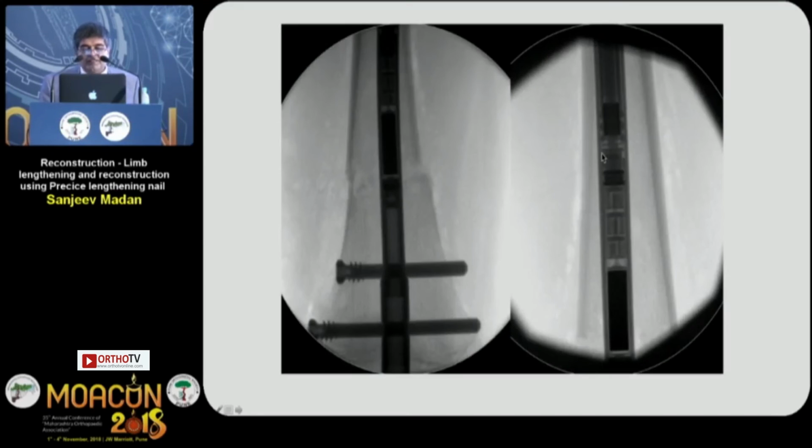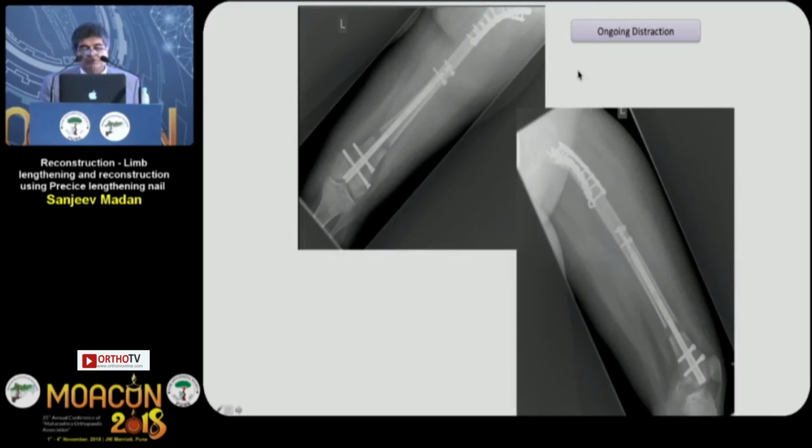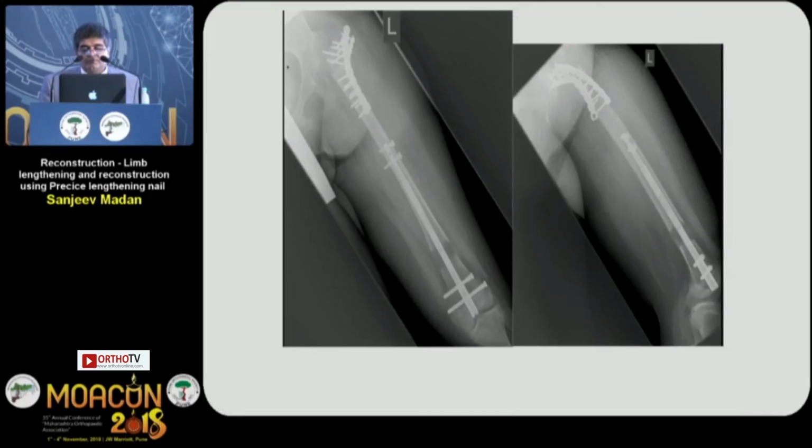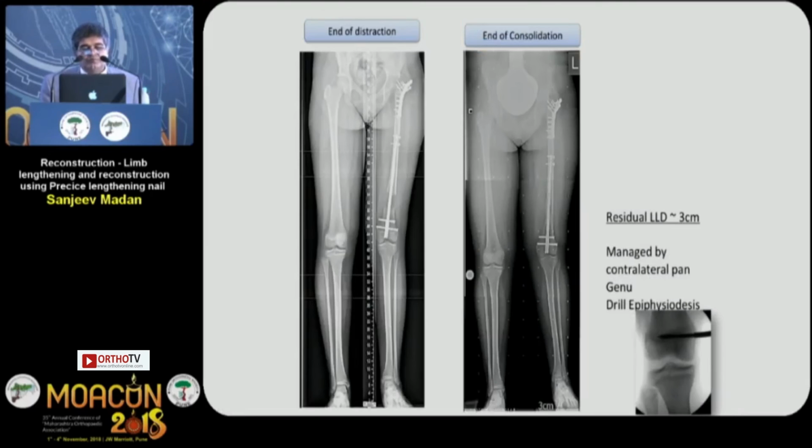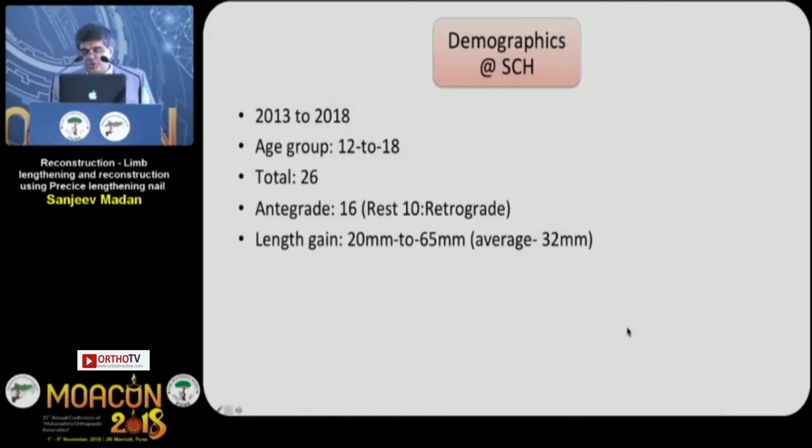And then the lengthening, and you can see this whole motor here. So gradual lengthening over time, and quality of the regenerate is good. And finally, end of lengthening and consolidation. You can do the contralateral epiphysiodesis to modulate the growth.